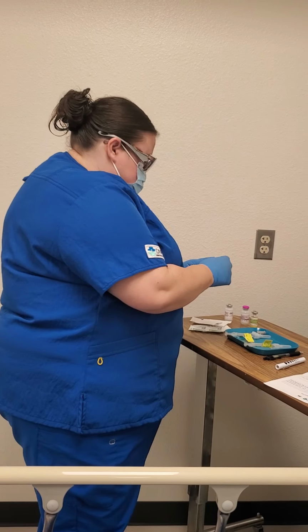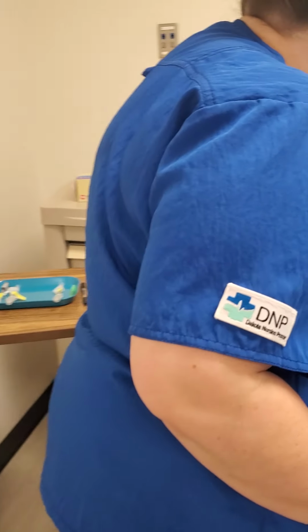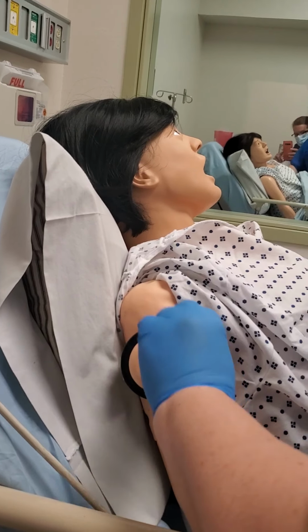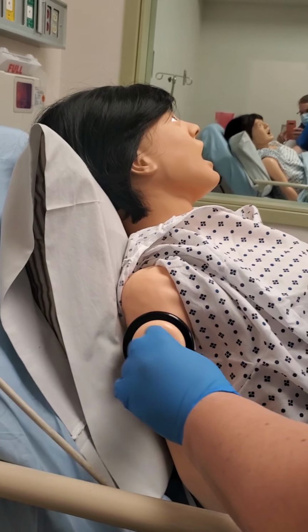Okay, so I'm going to sanitize the area here for the Phenergan injection. 15 to 20 seconds. I'm going to rub this area and clean it. Okay, 15 to 20 seconds.